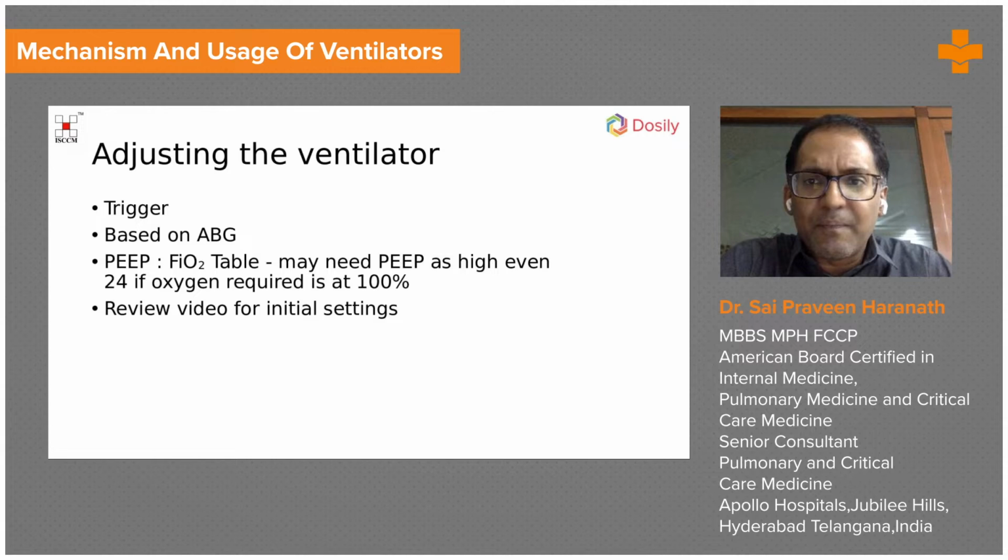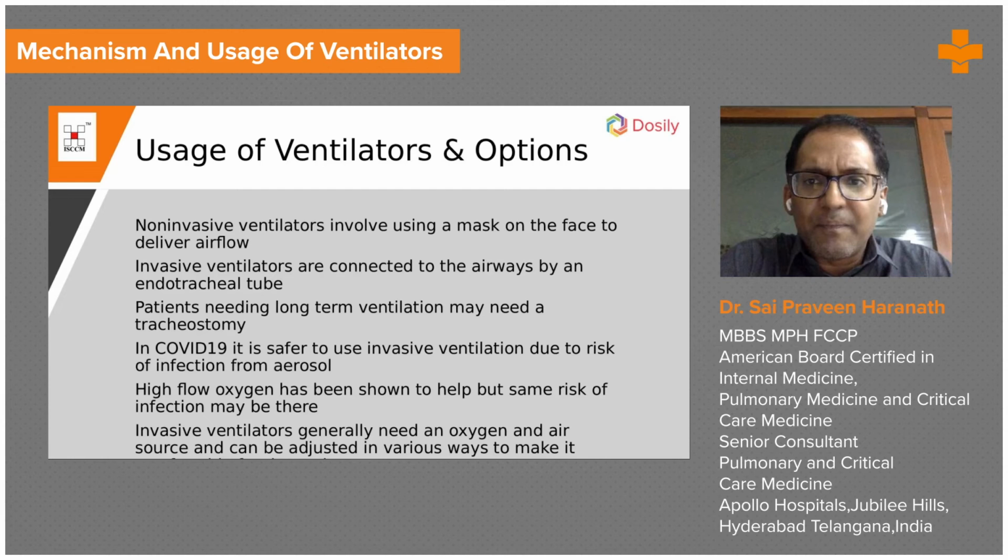When you adjust the ventilator, you base it on an ARDS. You also need to base it on an ABG. And we'll also need to review the PEEP FiO2 table. A PEEP FiO2 table is important as you start requiring higher and higher amounts of oxygen.